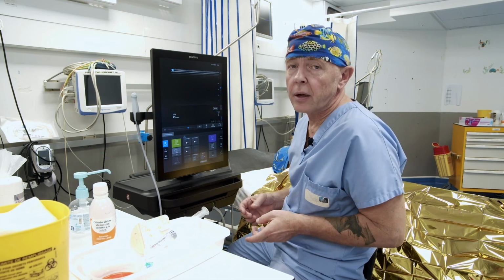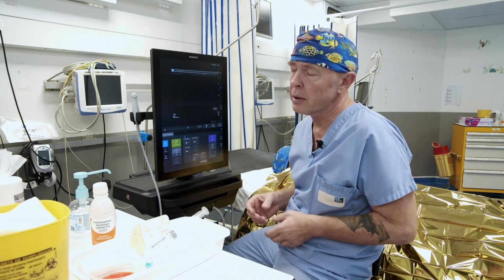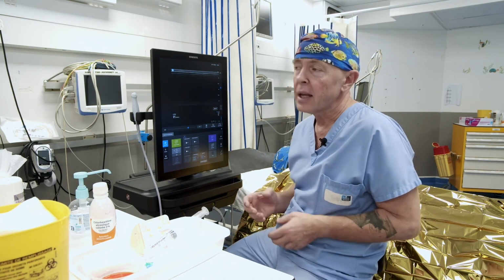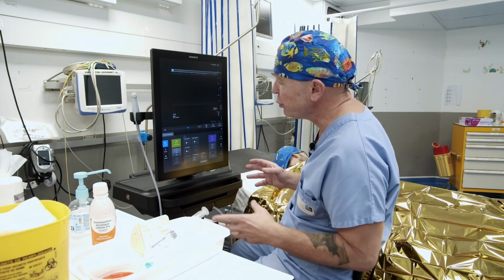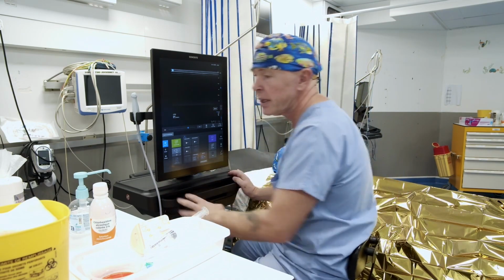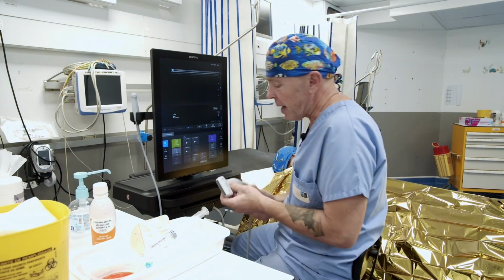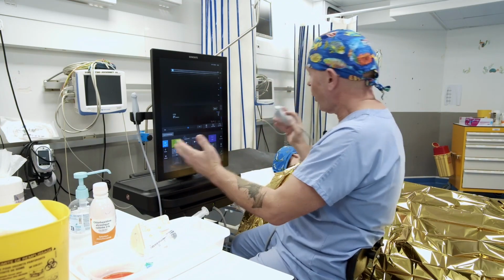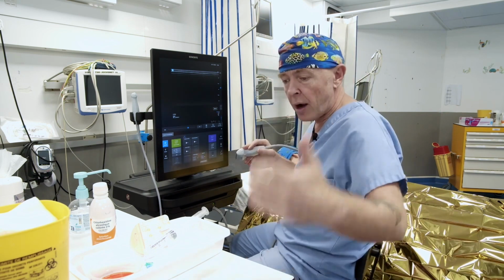Workshop number 5 corresponds precisely to step 5 of Evolubloc, which is ergonomics. It is also a fundamental concept. You need to allocate some time to contemplate the organization, how to position yourself effectively, and how to integrate an ultrasound machine into your environment. Consider a space. Position the display screen in relation to the patient. Attempt to organize in such a way that you have everything accessible at hand.